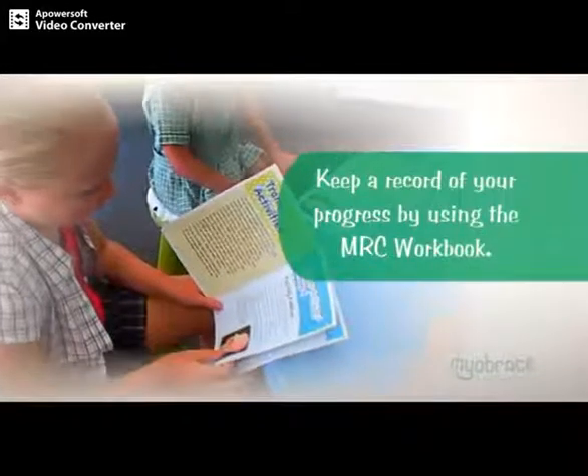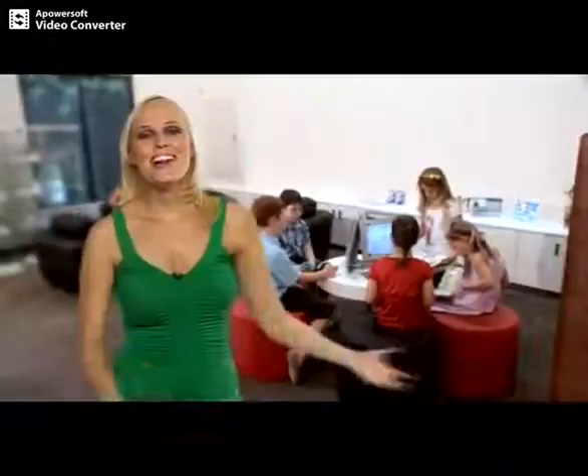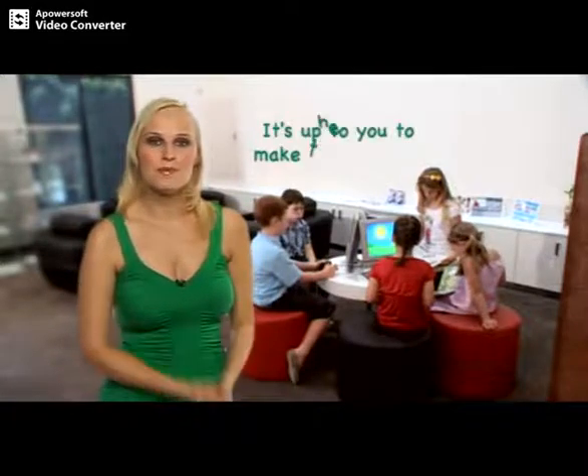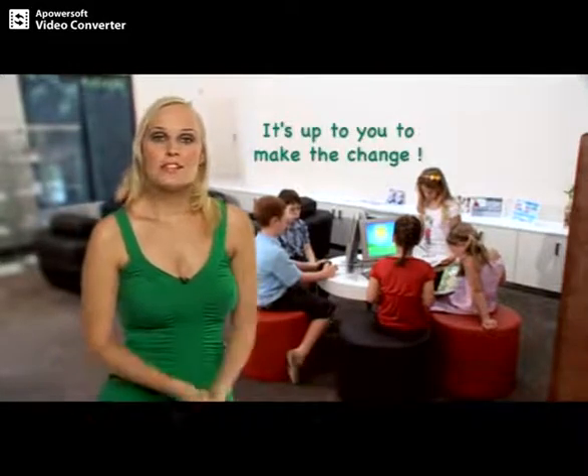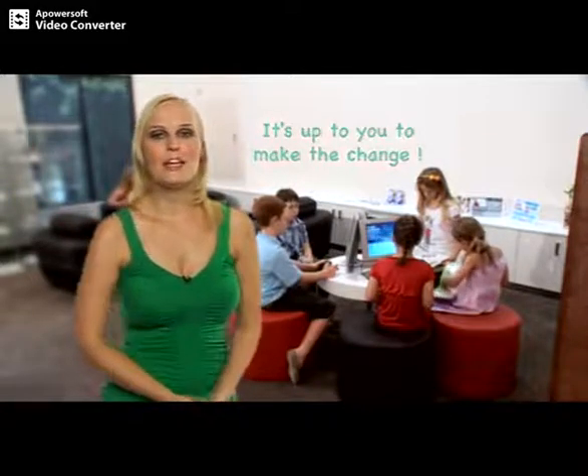You can keep a record of your progress by using the chart provided in your MRC workbook. Now you're armed and ready to start your activities. For the trainer treatment to work, it's up to you to make the change. By following these simple steps in the MRC trainer activities program, you will get great results.